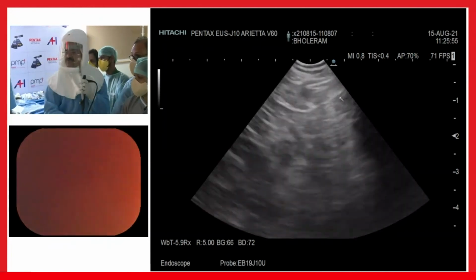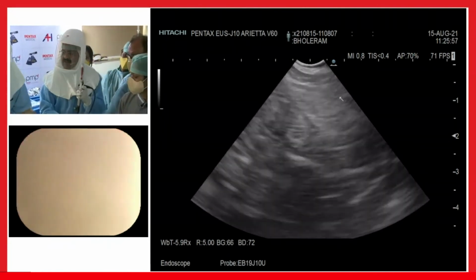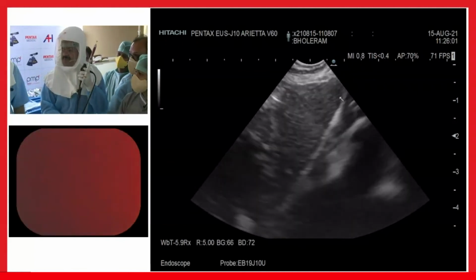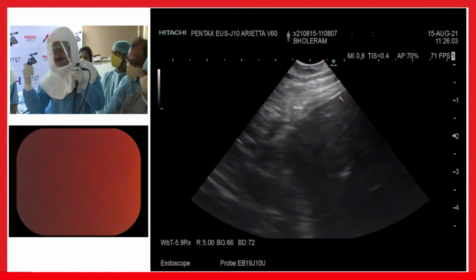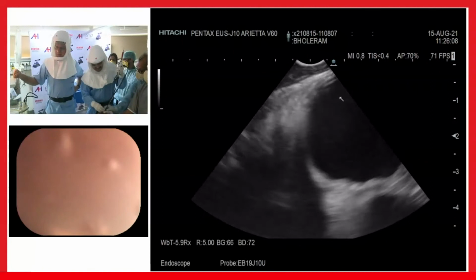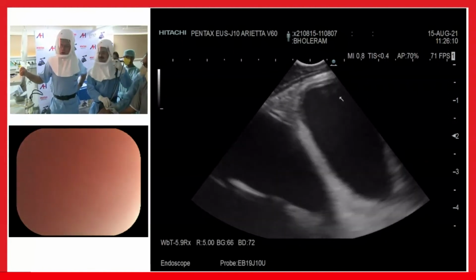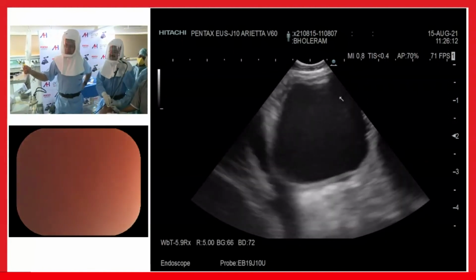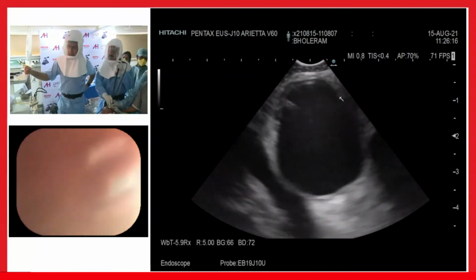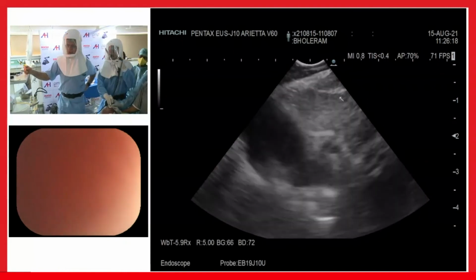Okay, so now, this is a very easy technique. 33 centimeters. Go down and see the liver. Withdraw, 33 centimeters. So this is left atrium, mitral valve, beautifully visible, and aortic root, and withdraw. Just take a minute.